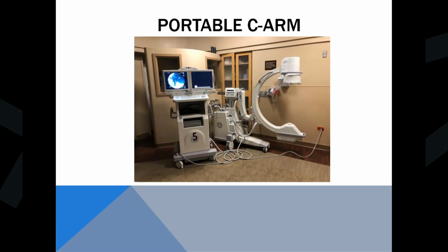So this here is like a spot shot. I was doing a PM on it, so I was taking various pictures of different phantoms and other things I could throw at the beam. You can also view the moving images on this screen. And then on here you can click the photo button, and it will store that last image on this screen, and then you can save it as part of your file.